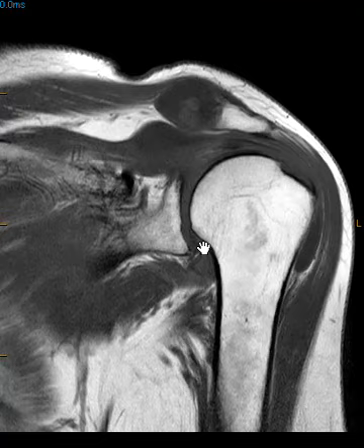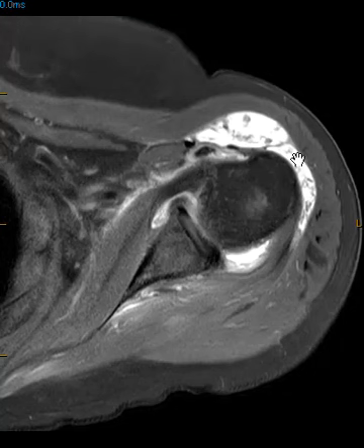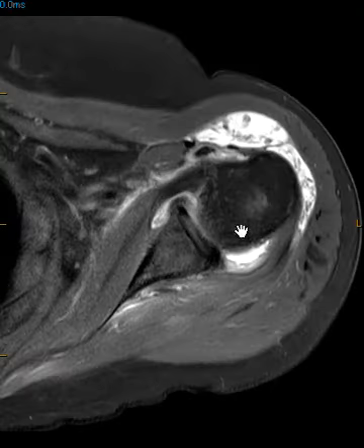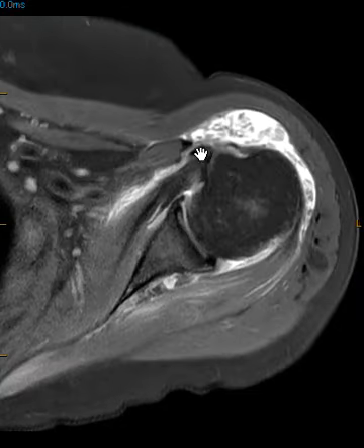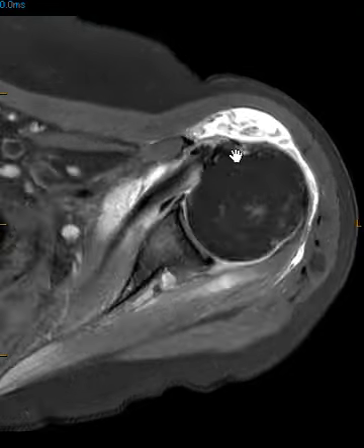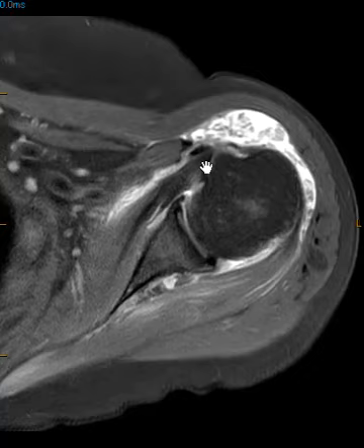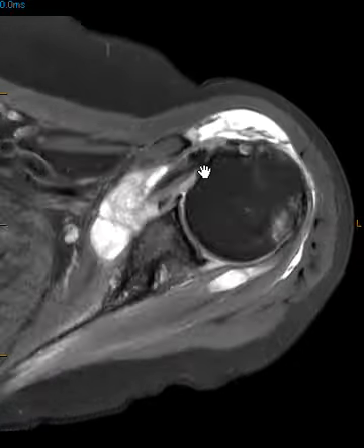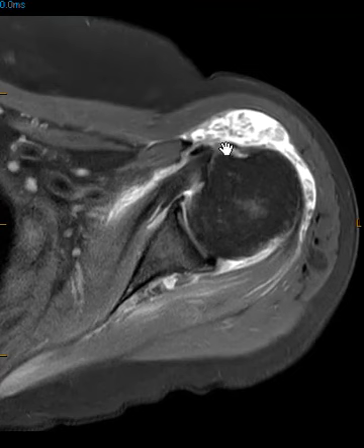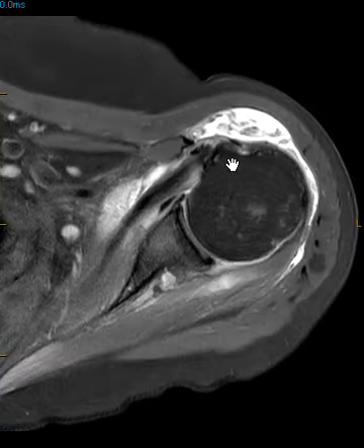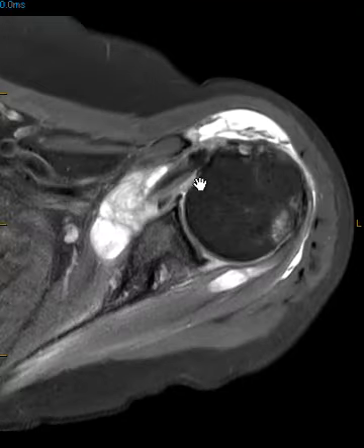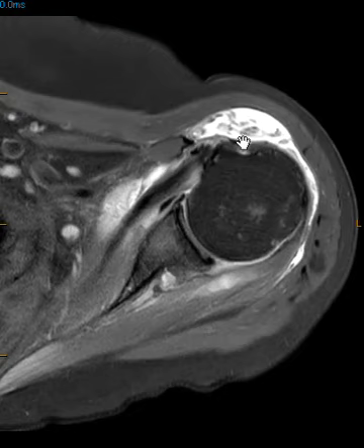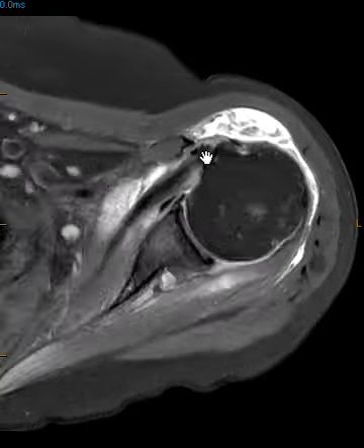We're not done yet. On this view we again see the large subacromial subdeltoid bursal effusion with rice bodies. We also see the biceps tendon — its sheath is filled with complex fluid, and instead of sitting in the bicipital groove here, it's over here superficial to the subscapularis. The biceps tendon is medially dislocated. The transverse ligament, which comes off the subscapularis and holds the biceps tendon in place, must be torn. The superior fibers of the subscapularis tendon and the transverse ligament component are torn, allowing for medial dislocation of the biceps tendon.